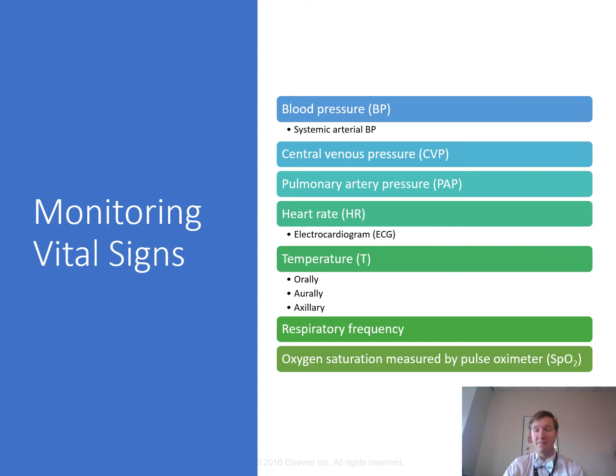It can help with fluid management. You might see them in post-op heart surgery patients. You might see them in your cath labs for diagnostic purposes as well. You may not see them too often. There's a lot of infection associated with these over the long term. So you don't see them as much, but you should be familiar with them.